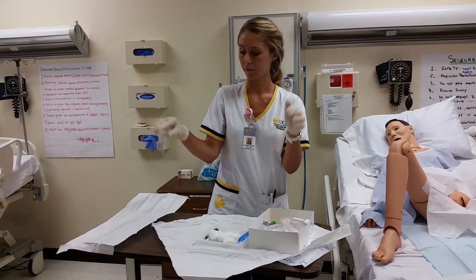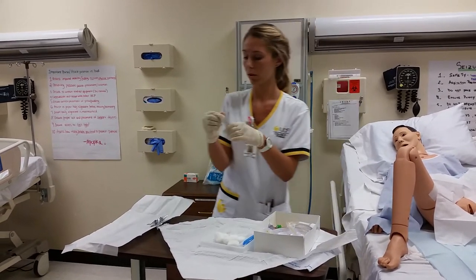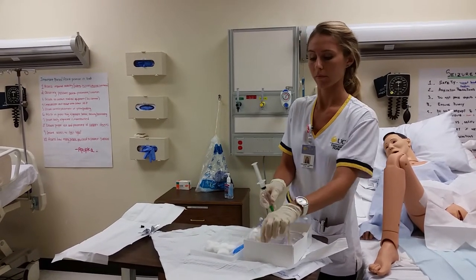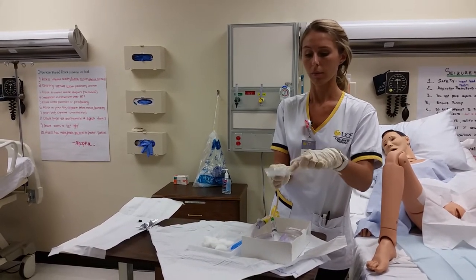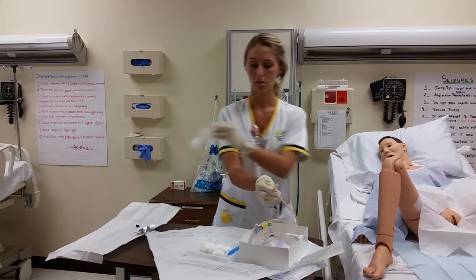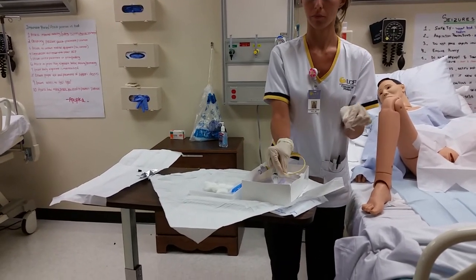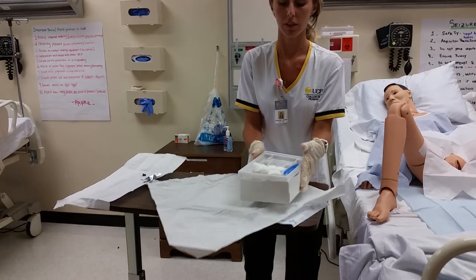I'm going to attach the syringe to the catheter. I'm then going to be very careful to remove the plastic on the catheter so I have full control. I'm going to go ahead and lube my catheter. Put my kit back together and move over to the sterile field on the bed.